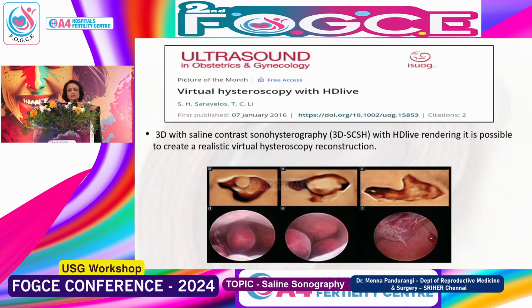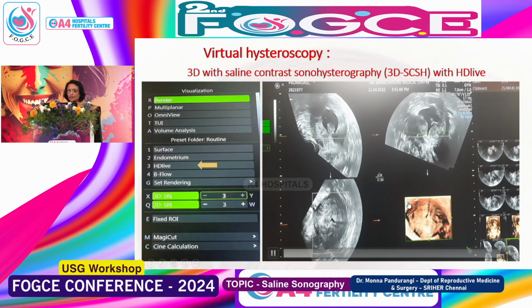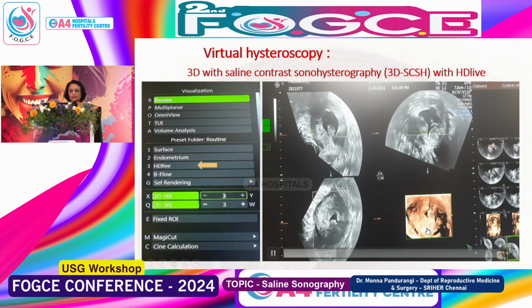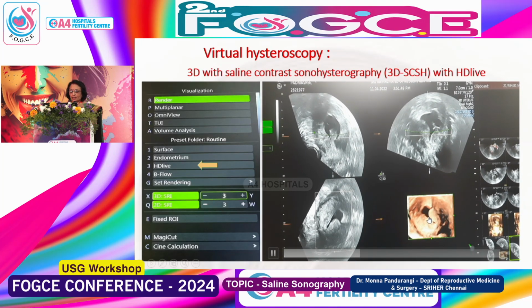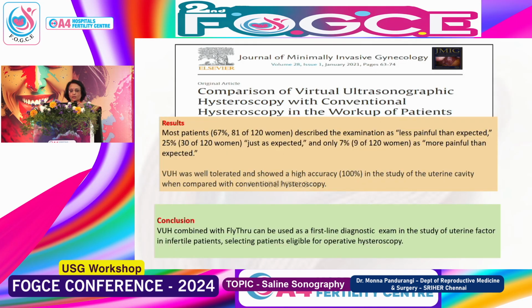It's almost done. This is virtual hysteroscopy wherein you can combine 3D and almost go through the cavity, seeing the polyps within it, and then decide whether you can go in for hysteroscopy or not.